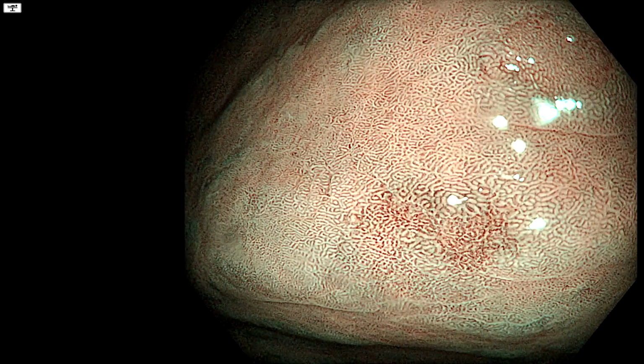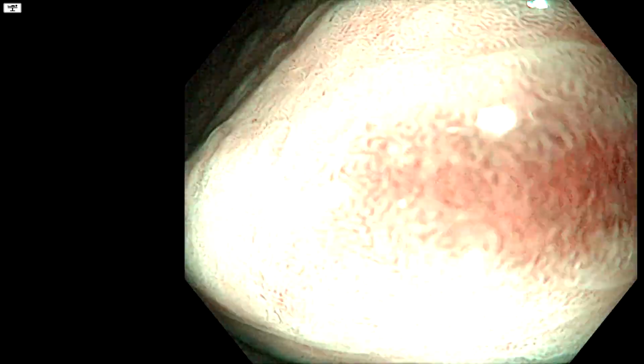Here in this area you have the standard regular pattern of the stomach. I'm specifically not using difficult words here, or words associated with previous eponymous or described signs. I simply want to describe this in terms of regularity. In the center of this image you see a pattern where it's darker than the surroundings, but the pattern is entirely regular. So this is likely to be not very much. Let's go to another one.